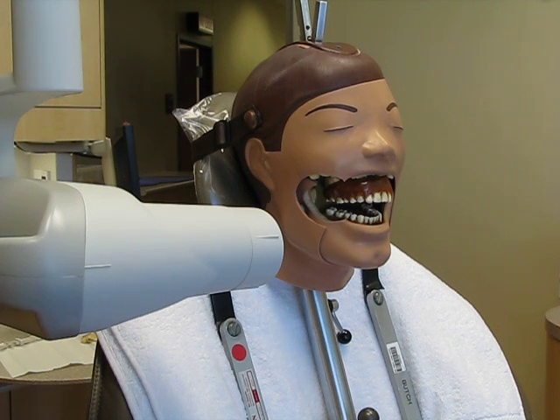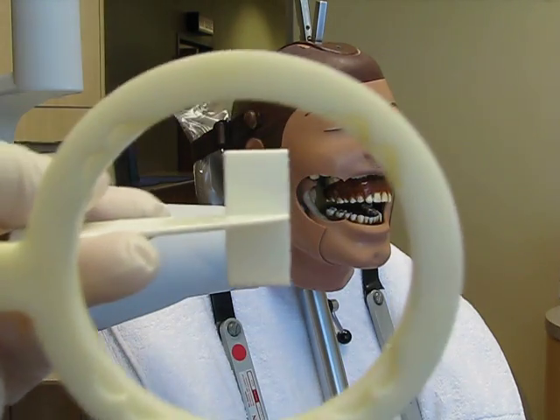We talked about it in lecture, in lab, that for the maxillary, the dot in the slot in the anterior and the posterior is always going to be towards the incisal. For the mandibular, anterior and posterior, it'll always again be towards the incisal or the occlusal. Okay. Now bite wings are different. Okay.